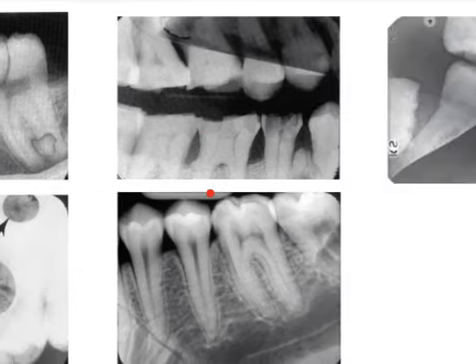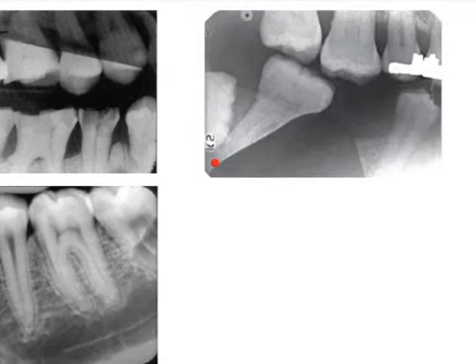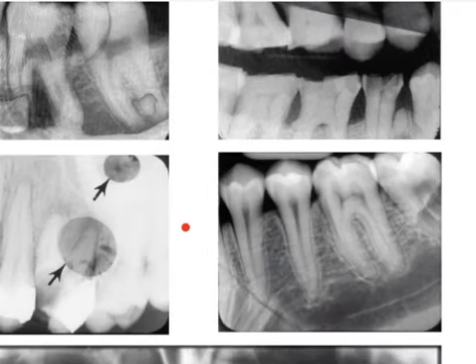Then black paper sticking on the film. You can see that there is black paper stuck with the film. This did not allow that area of the film to be completely fixed once the developing was done. Then the next is here. You can see again there is a black image because of the excessive bending, as you can see here. Bending can leave a line.